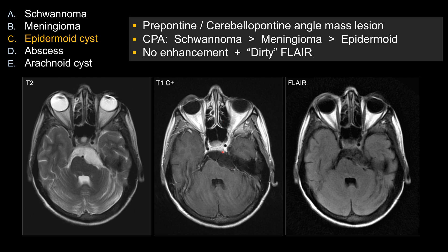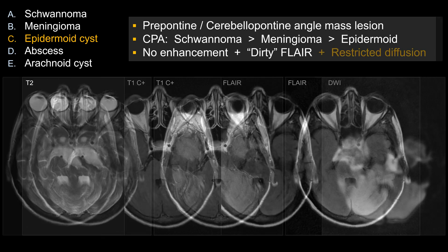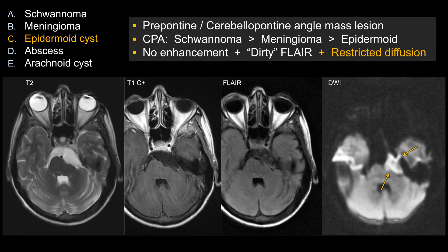In this case, you can see there is no enhancement, and there is a lack of complete suppression on FLAIR. Otherwise, if this were exactly like CSF on all sequences, you would be looking at a potential arachnoid cyst.